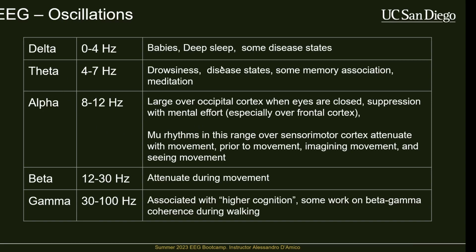Theta waves are very popular. They're especially popular nowadays, and I know the Wojtek lab talks about them with nested oscillations. So you can have more than one oscillation happening at the same time, and you essentially need different techniques to analyze these types of signals.